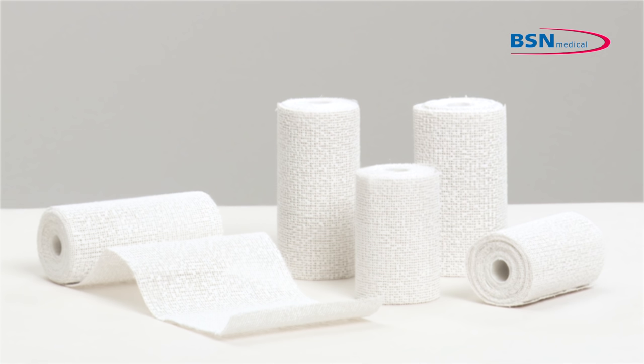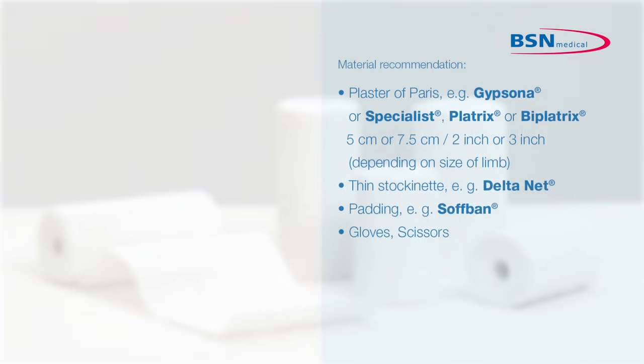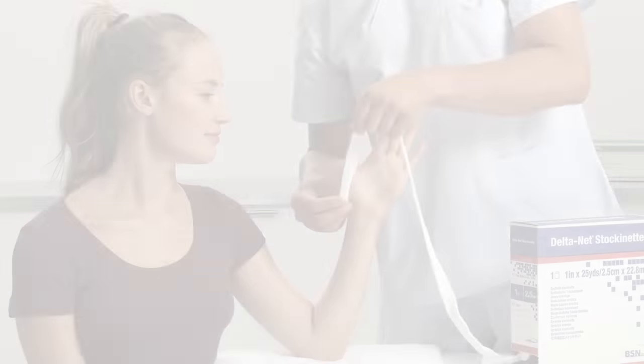Before the start of application, define the position of the limb. The wrist should be in slight dorsal flexion, a neutral ulnar radial deviation or slight supination. This will give the patient an indication of which position he has to maintain the limb.